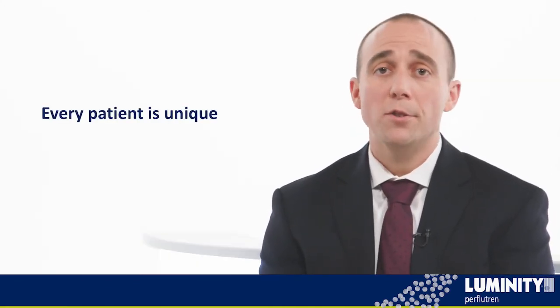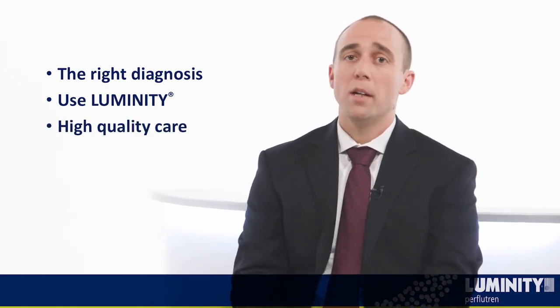We know that each patient is different. We know that each pathology is different, and it's up to the sonographer to ensure that you're getting the best images you can, but most importantly, to make sure you're getting the right diagnosis. At the end of the day, it's really about getting the correct cardiac diagnosis, making sure we get the best images that we can to ensure high patient quality care.